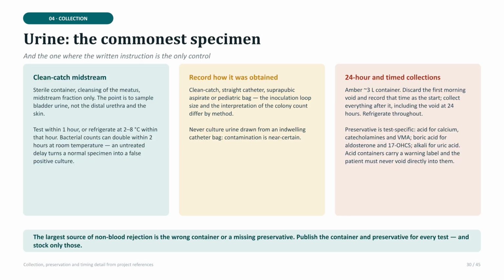Finally, urine collection is frequently misunderstood. Because it is often collected by patients, your written instructions are the primary control for preventing poor specimens and ensuring timely transport to the laboratory.